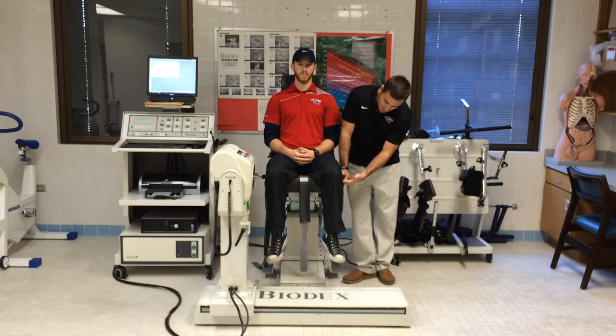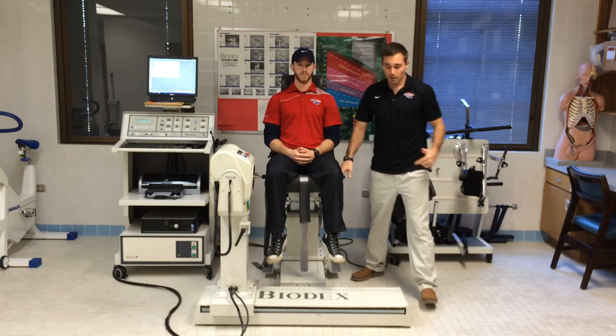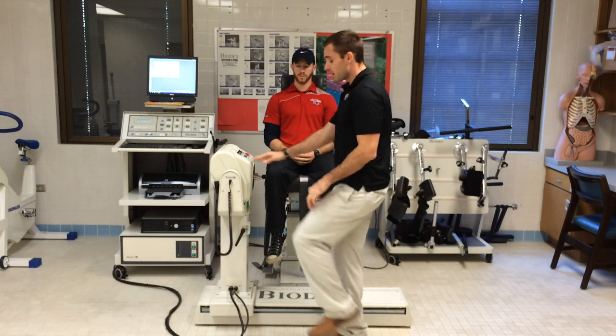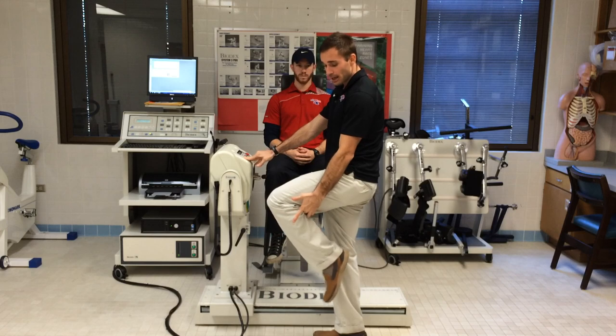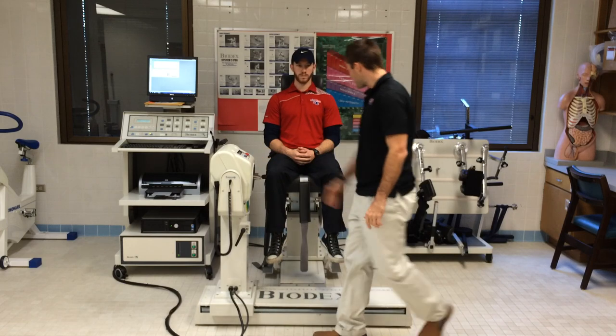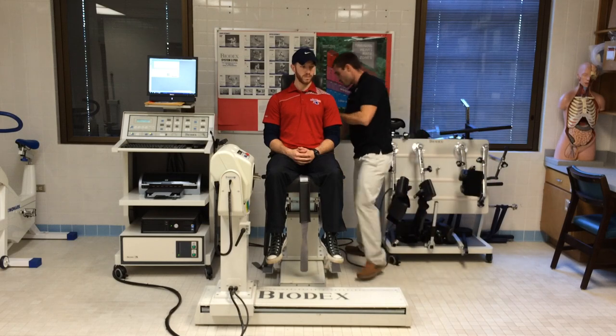What I'm looking for is about 2 fingers worth of separation between the back of his leg and the chair. When he's doing the test, he needs to be able to have full extension and flexion. And if the chair is too tight, he's not going to be able to move his leg back far enough. So he looks a little bit snug there. I'll probably pull him forward just a bit.